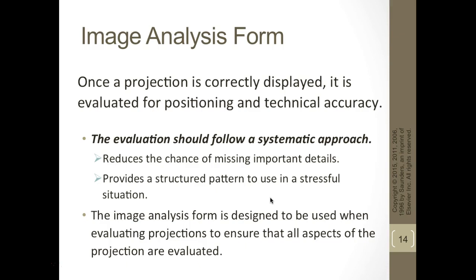So within your book, they talk about the best way to do that. In box 1.1 it shows you the image display guidelines, which are really good on how an image should be hung. And then they talk about how contrast masking is bad, and then your image analysis form. I didn't include it in here because, as you can see, it's 2 pages long. So these are all the things when Jill and I come out and talk to you. These are the things that we're going to be asking you, what you find on page 8 and 9 in chapter 1 of your book. We're going to look, is there grid lines? Is there any artifacts? Is the VOI centered?